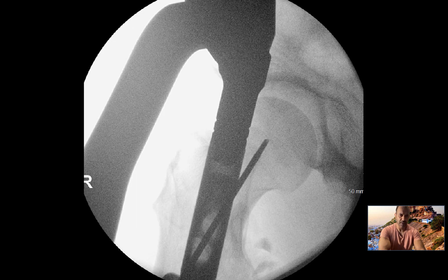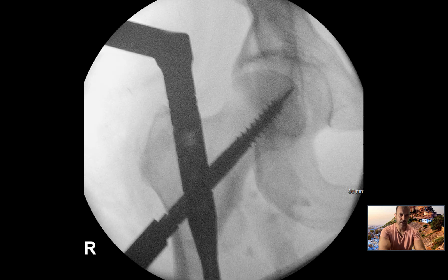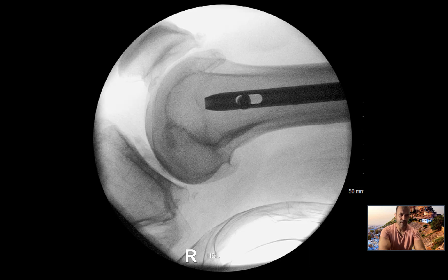Here's what I mean by a center-center position in the head. You get a center of the guide wire in the head, and that, if you get a true lateral of the knee and perfect circles, will correlate to 15 to 20 degrees of antiversion, depending on your nail design. It's a very useful trick when you have bilateral femoral injuries.